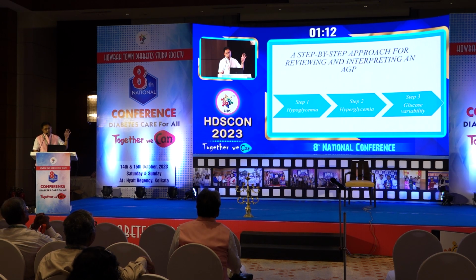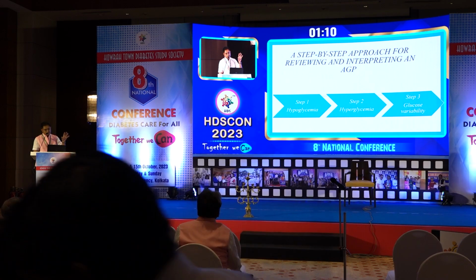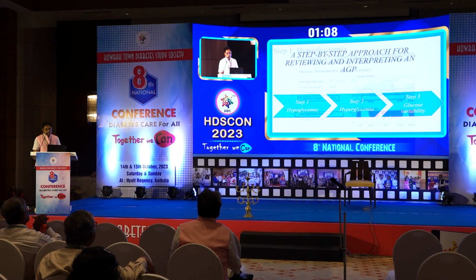So there's a step-by-step approach. First, we have to search for hypoglycemia, then hyperglycemia, and third is glucose variability. So here we can see that the patient has 24% below the target, and the low glucose events were almost 27, that is almost 131 minutes in a day.